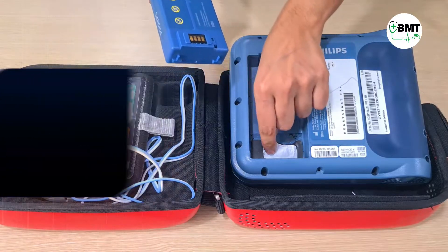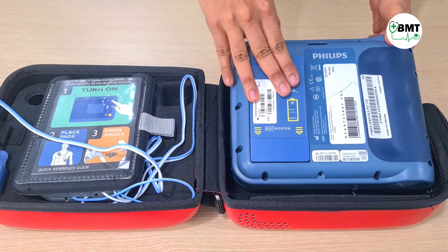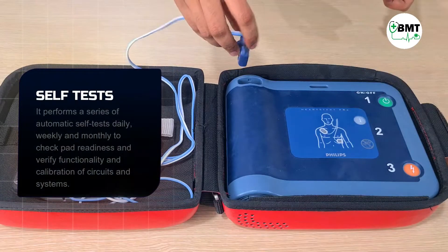So now this battery is deactivated. To activate it, remove the cover and then connect the battery. Insert and press. Connect the connector.